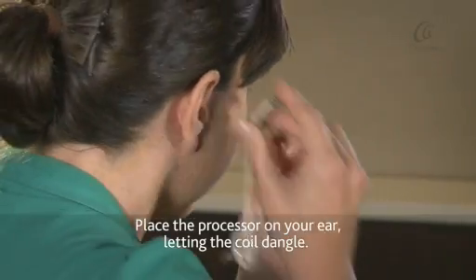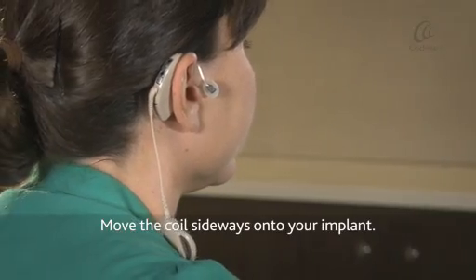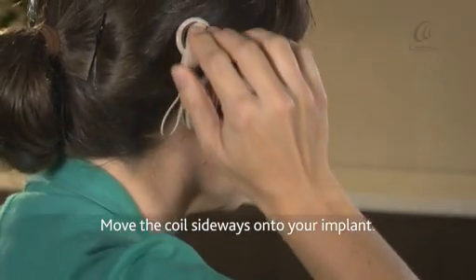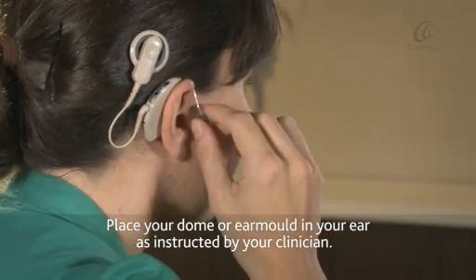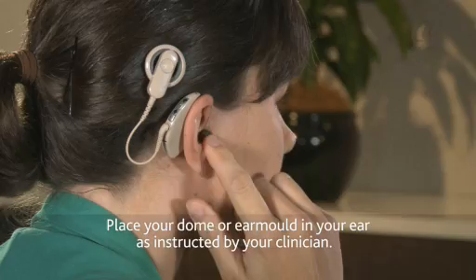Place the processor on your ear, letting the coil dangle. Move the coil sideways onto your implant. Place your dome or ear mould in your ear as instructed by your clinician.